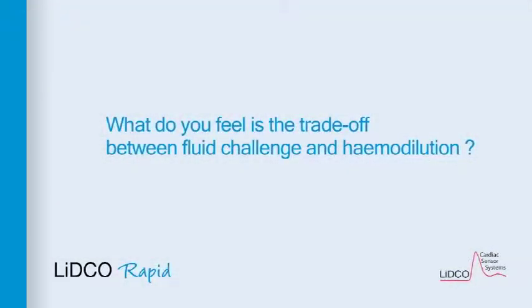What do you feel is the trade-off between fluid challenge and hemodilution? I think that's a very important point. Most anaesthetists forget about the effect of their fluids on hemodilution. Now, when we're giving a fluid challenge, we're expecting stroke volume, say, to increase by, if we're lucky, up to 10%. If you're giving fluids to the patient, colloids for example, and you're getting an increase in stroke volume of, say, 5%, but at the same time, you're actually getting a hemodilution, reducing the hemoglobin content of the blood by more than 5%, you're actually reducing oxygen delivery. This clearly confers no benefit to the patient.